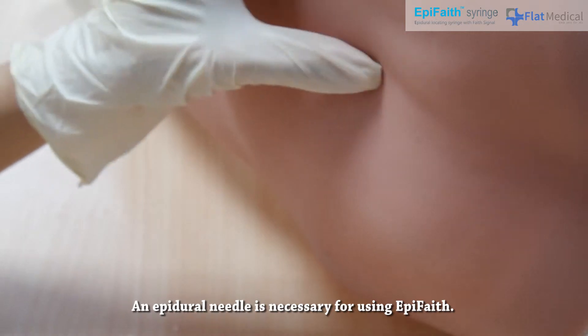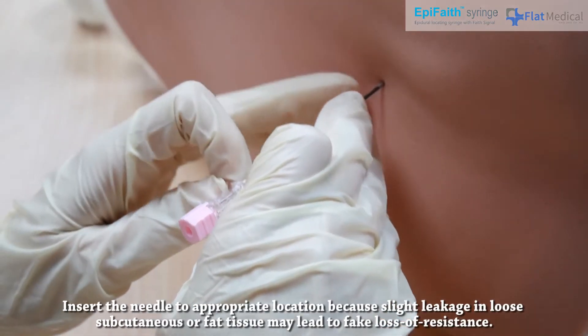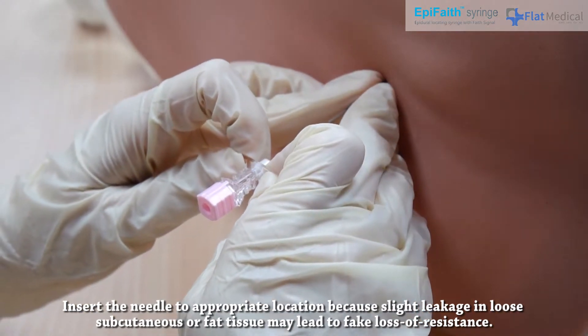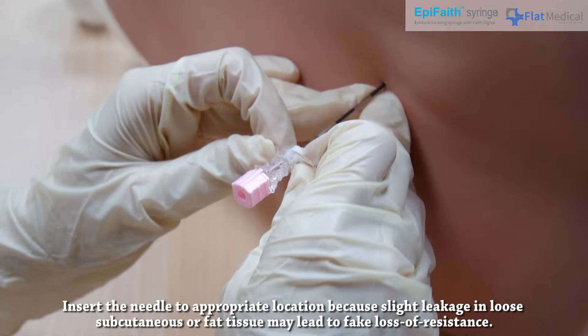An epidural needle is necessary for using EpiFaith. Insert the needle to an appropriate location, because slight leakage in loose subcutaneous or fat tissue may lead to fake loss of resistance.